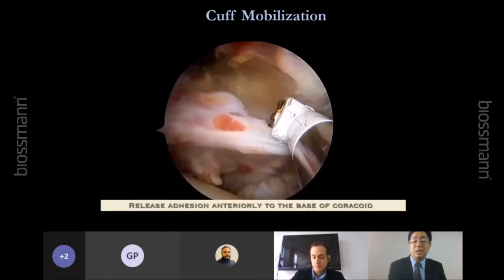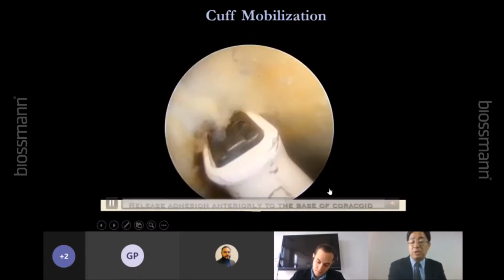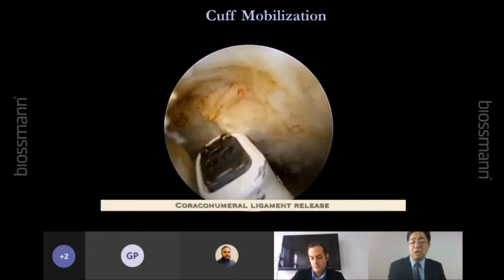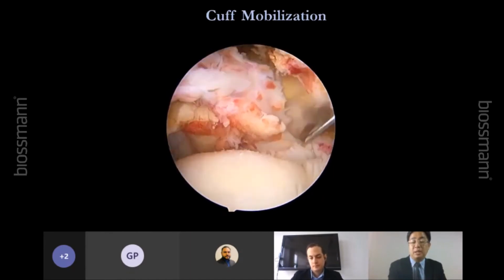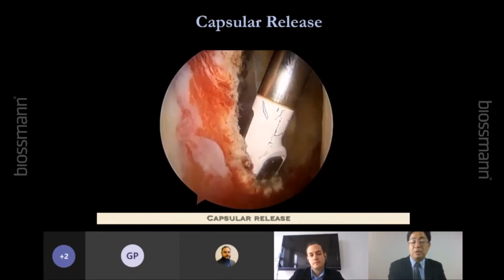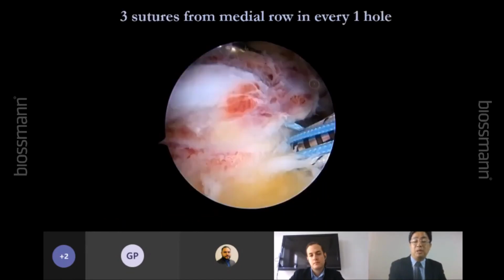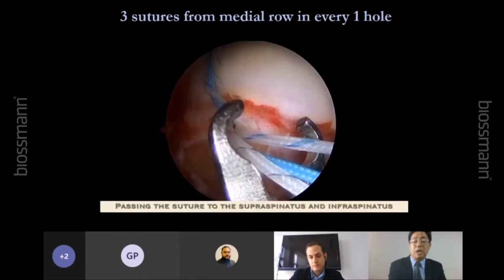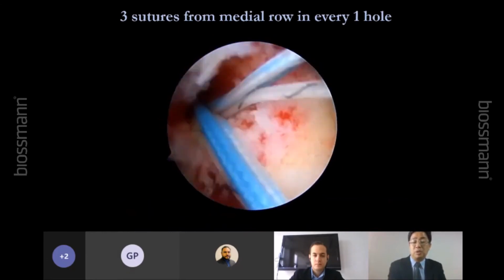Okay, so after the release, the cuff mobility is getting better. So I think this is the key. You need to release the cuff from the coracoid process like that. Okay, release the coracohumeral ligament. Okay, and then test the cuff mobility again, right? And then also release the capsule. Then this patient also has stiffness. I release the anterior capsule and IGHL anterior capsule. Okay, and then we put the footprint, 2 anchors on the medial side, triple. So this patient, I put 3 anchors on the medial side. Then we make a 3-in-1 hole. Okay, like that.